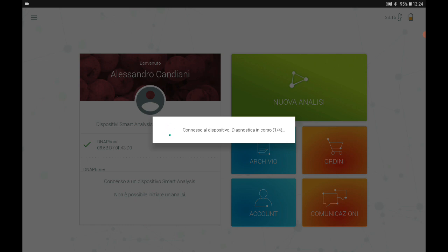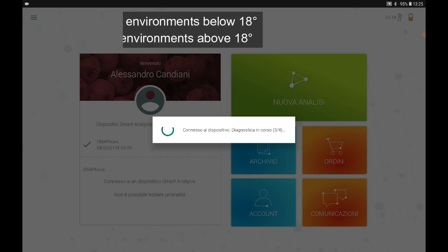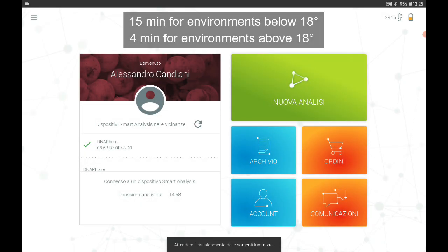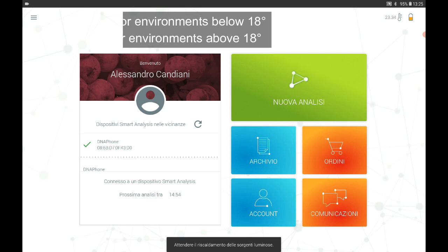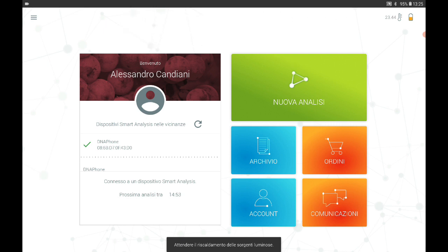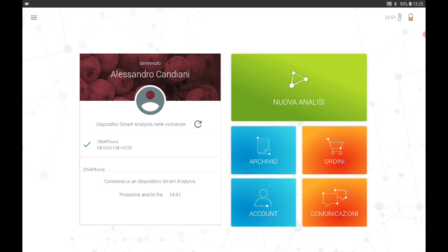At this point you run a diagnostic phase in which the app checks that everything on your device is working properly. At the end of the first diagnostic phase a 15-minute timer starts. During this timer you cannot do any analysis. This time is necessary to stabilize the instrument sources and warm up the reading cell to the correct temperature of 37 degrees.